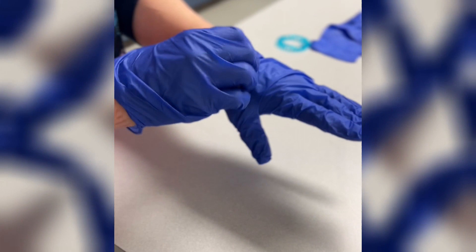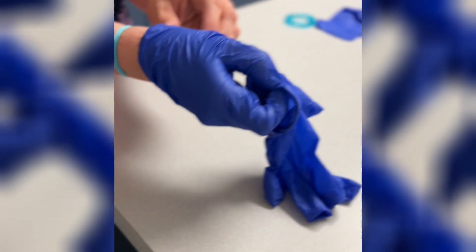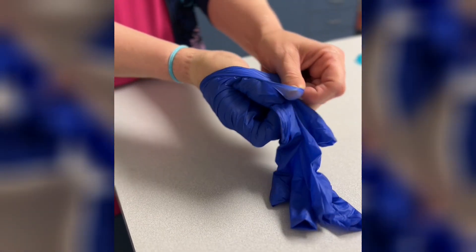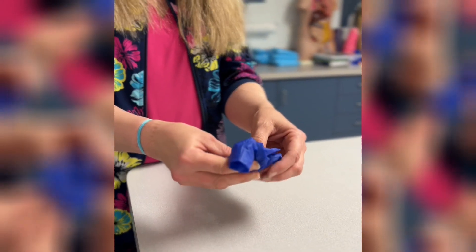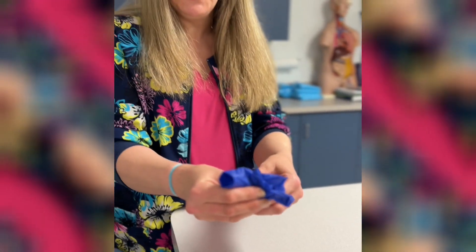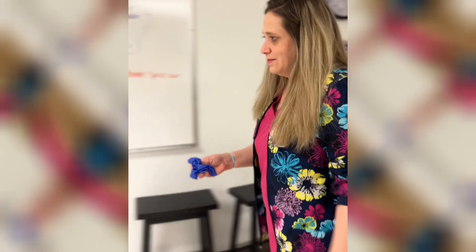To take gloves off, pull them away from your body and make sure they come off inside out. For the second glove, pull it away from your body inside out as well, tucking the first glove inside the second glove. Then dispose of the gloves properly. And that is the proper way to put on and take off gloves.